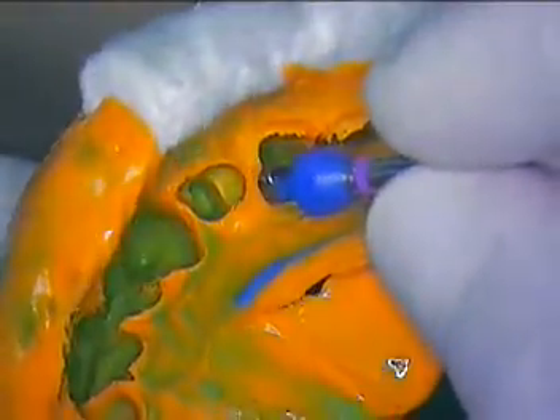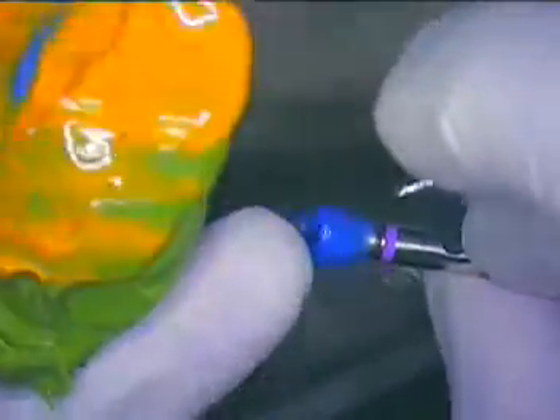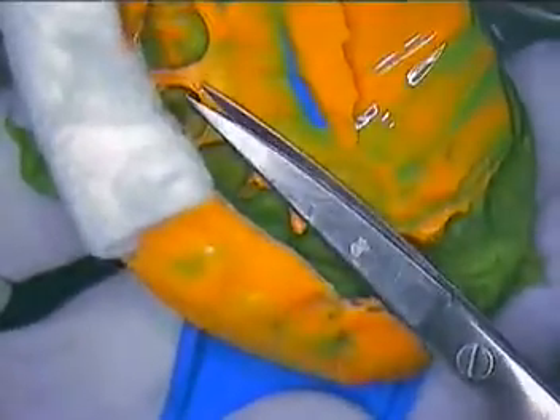Now we've taken that wax out — that's important, don't forget to do that. Then come back in here and there's our impression. Let me have the scissors please. I'm going to show you how this slides right back in. You want to make sure you're on the right side. See the two little dots I have in there — that's going to go toward the buccal. I'm just going to get rid of just a tiny bit of tissue right here. That's gone, good.